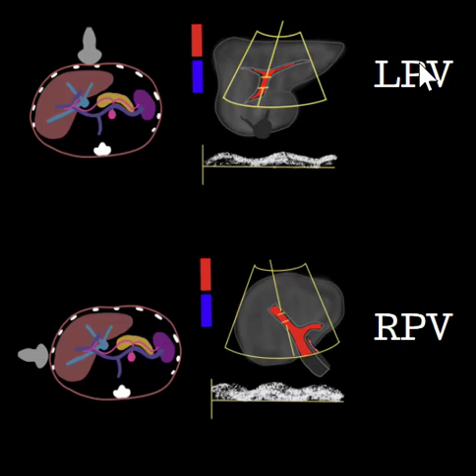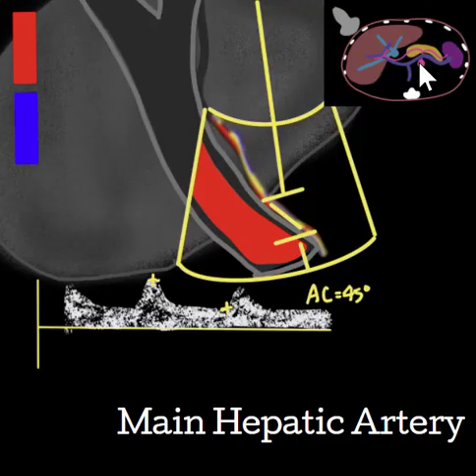To get ready for your last image, decrease the color scale, also known as the PRF. With a decreased color PRF, the main hepatic artery will go into aliasing. This aliasing will draw your eye to the small artery as it courses next to the main portal vein. Using a right intercostal window, the main hepatic artery will be red. Placing your sample gate outside of the liver with angle correction on and less than 60 degrees, the waveform should be low resistive and above the baseline. Measure both the peak systolic and end diastolic velocities.